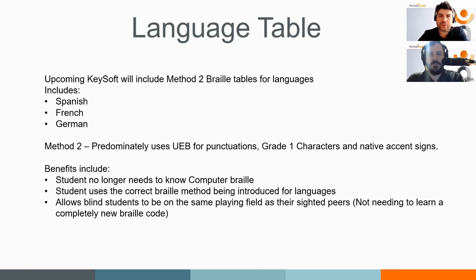Okay, and the Takeoff files are already on the Touch Plus SD card, right? As a question, I believe they should be. I'm not sure if they've started to be introduced yet, but the plan is to get these Takeoff files on the SD card that comes with the device out of the box. But if you haven't got a fairly new one, then as I mentioned, you can download those straight from HumanWare's website.